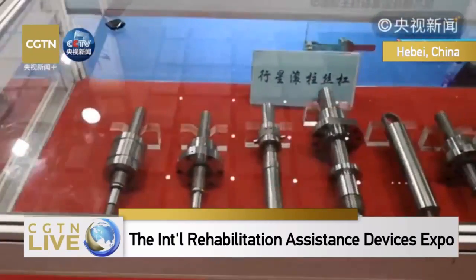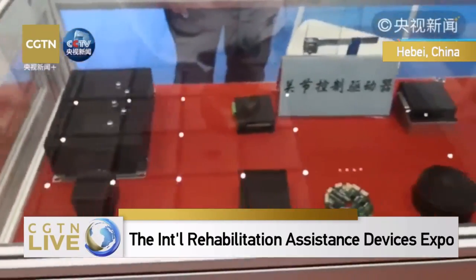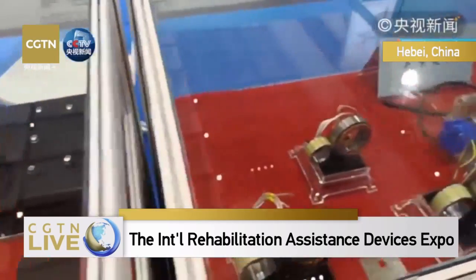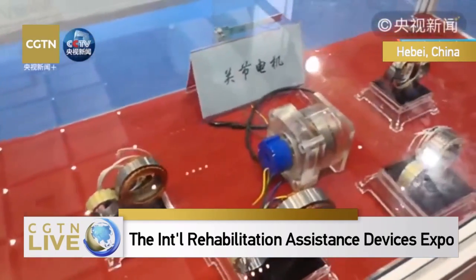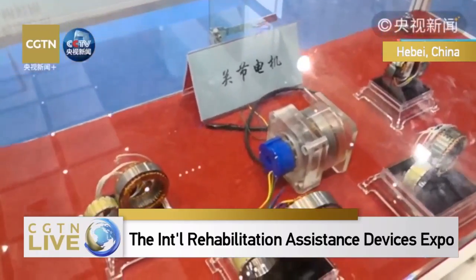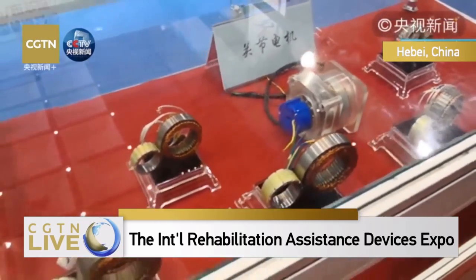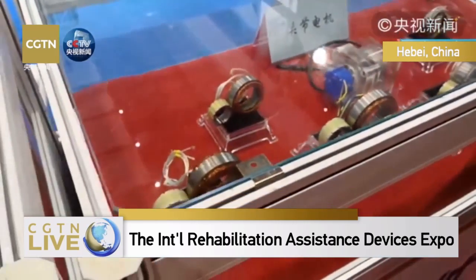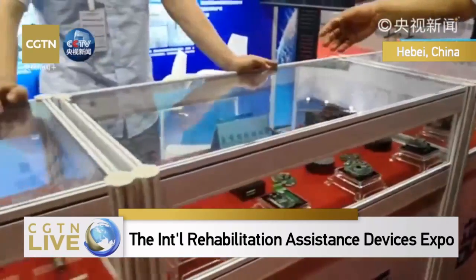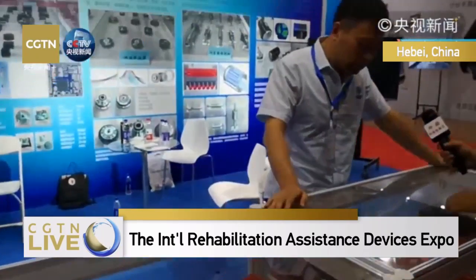These seem unrelated to the rehabilitation industry. They might be a part of robots that used to be serving the army, but after some modification, I can just take this as a model and implement it in devices that can be used in daily lives. Can you tell us what these are for?